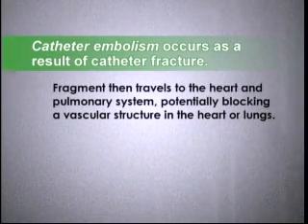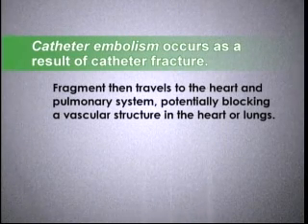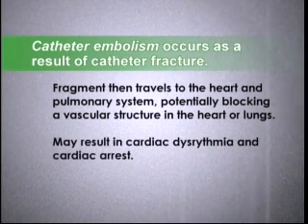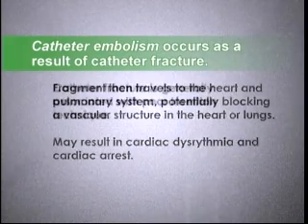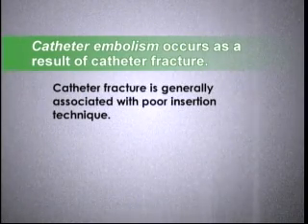Catheter embolism occurs as a result of catheter fracture. The fragment then travels to the heart and pulmonary system, potentially causing disruption of circulation by blocking a vascular structure, either the heart or lungs, which may cause cardiac dysrhythmia and cardiac arrest. Catheter fracture is generally associated with poor insertion technique.